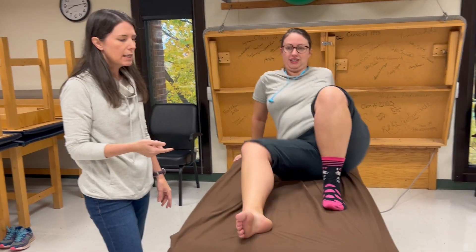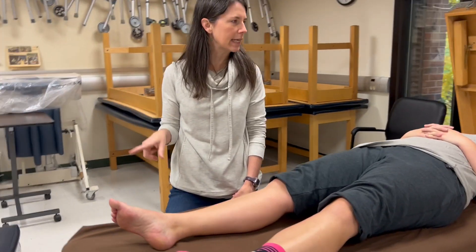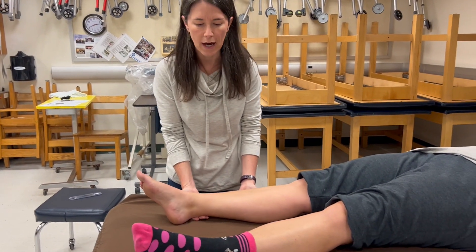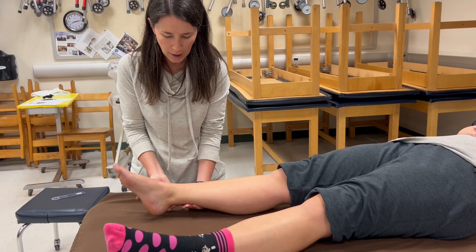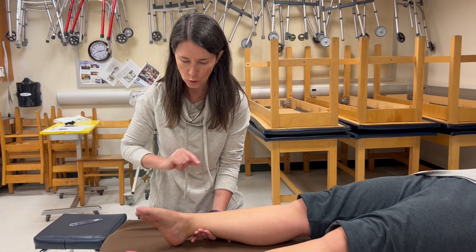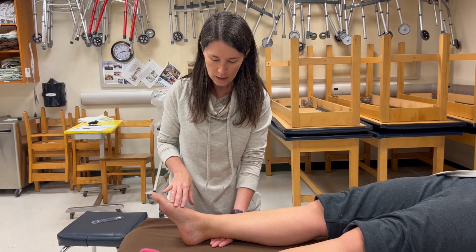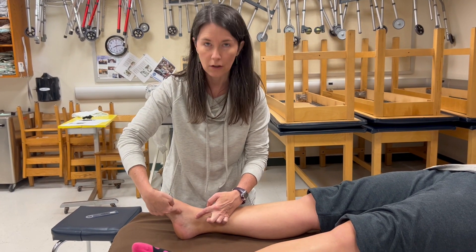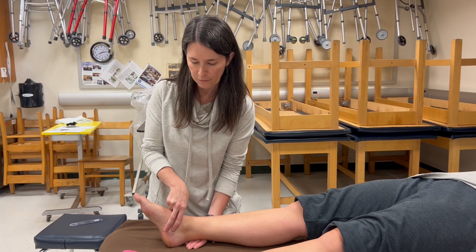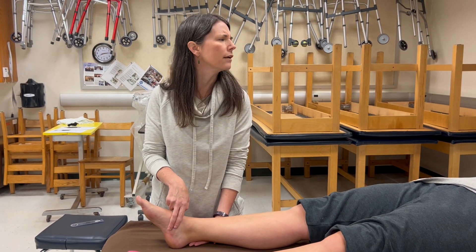For gravity-eliminated testing, she rolls onto her back. Technically short sitting isn't gravity eliminated, so I'll use the supine option. I'm going to prop her foot up a little so she doesn't have to work against friction on the table. I ask: can you bring this foot in toward the other one? If she can do that, she's earned her two. If she can't, I palpate the posterior tibialis tendon between the medial malleolus and navicular, at the height of the arch. If she can't move but I see or feel anything there, I give her a one.